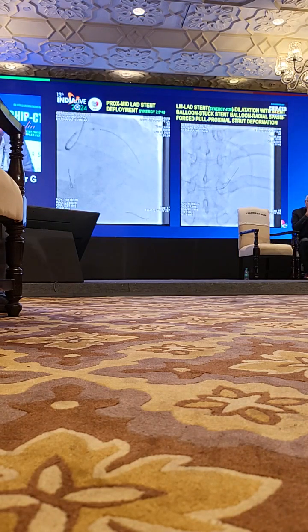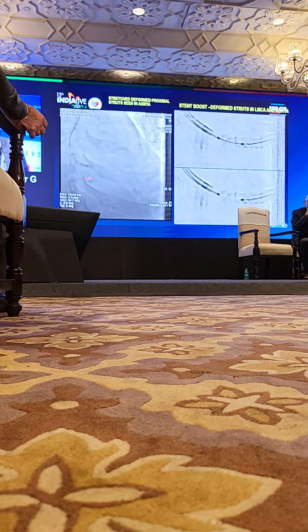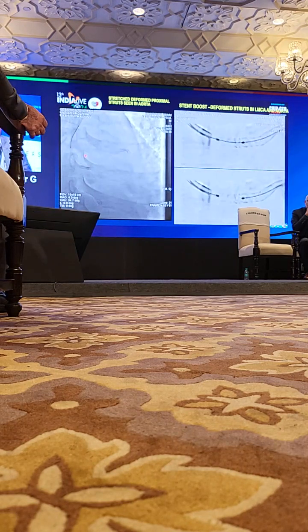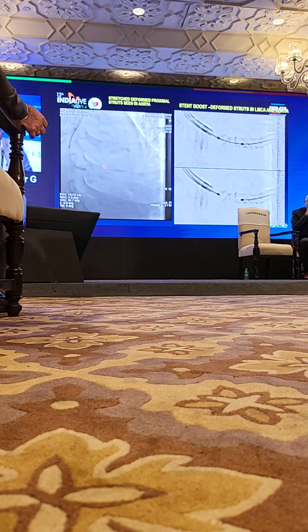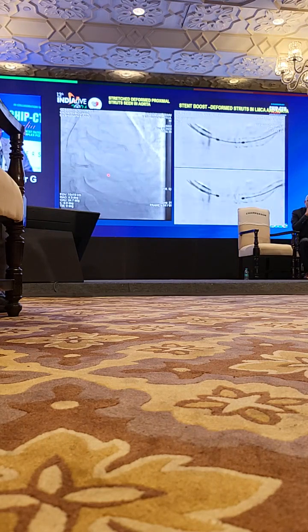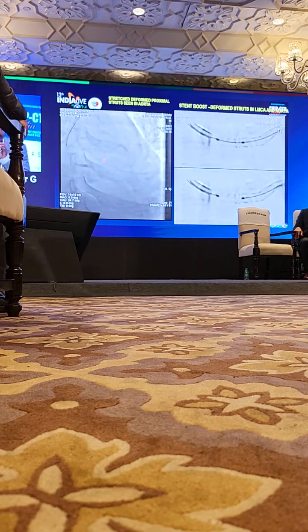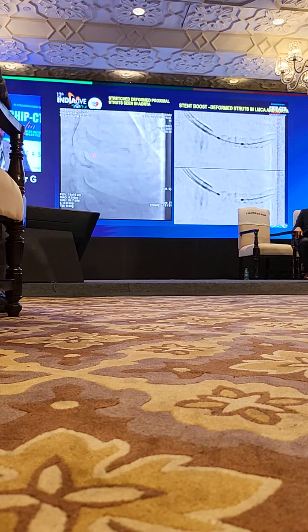After flaring up the ostium, I was not able to pull back the stent balloon. It got stuck. I found resistance because all this was done through the radial approach, and there was severe radial spasm. With so much difficulty, in spite of repetitive negative pressures in the inflator, I somehow pulled the stent balloon out. But then I realized that the whole guide and the guide wires had come out. I found that the proximal LM LAD stent got stretched into the aorta.